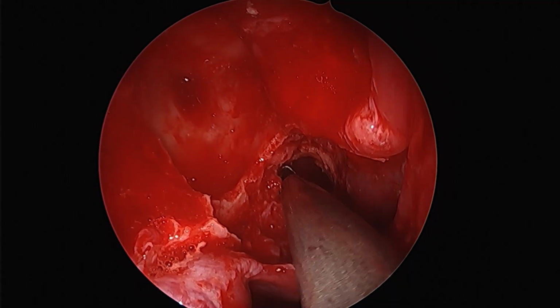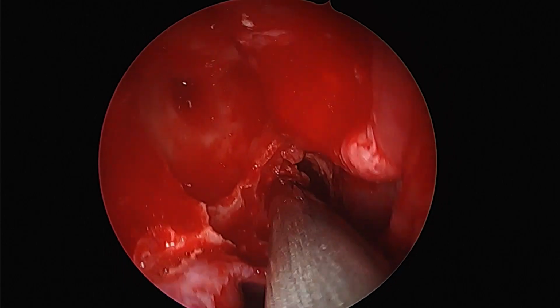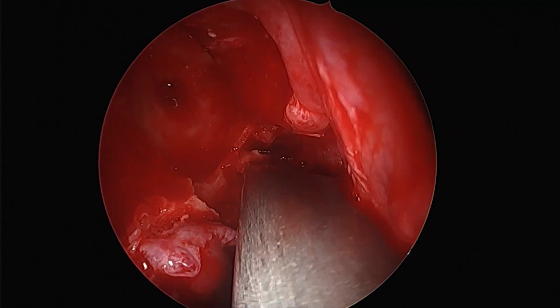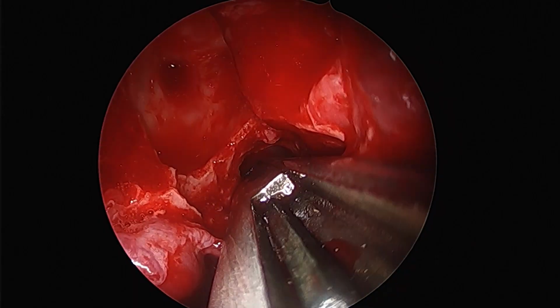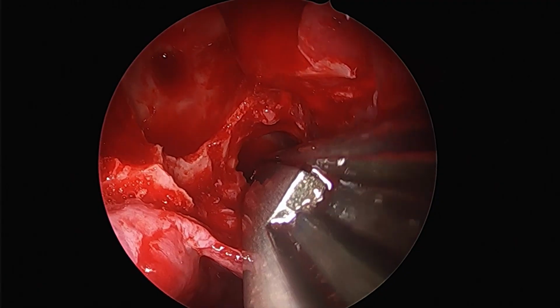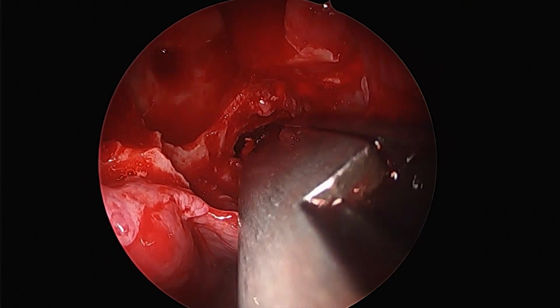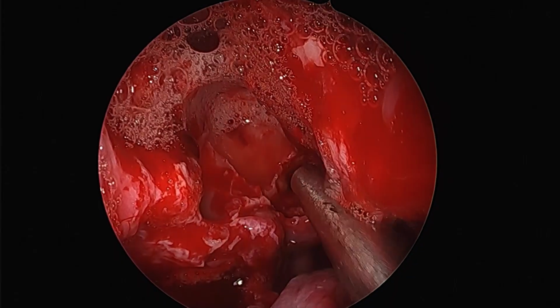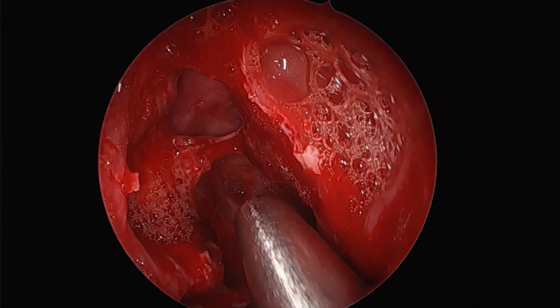We are not using any cutting burr, and post a generous opening, we can resort to using our Hajek-Kofler punch to increase the opening both inferiorly as well as slightly laterally, to be able to secure the fact that this sphenoid sinus in the post-operative period remains not only open for inspection and examination in the office, but also for liberal nasal irrigation, high volume irrigation in the post-operative period, which we would definitely be advising for this patient, whether as standalone or infused with steroids such as Budecort.